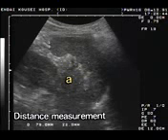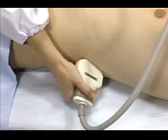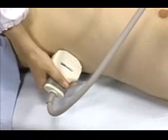Based on the degree of enlargement, various infectious diseases, blood dyscrasias, diffuse hepatic diseases, portal hypertension, or metabolic diseases are suspected. The spleen closely reflects the condition of the liver. A splenic abnormality suggests hepatic disease. This finding is helpful in evaluating the liver later. At times, a swollen lymph node can be detected in the periphery of the hilum of the spleen. As you see, the spleen looks the largest in this plane.